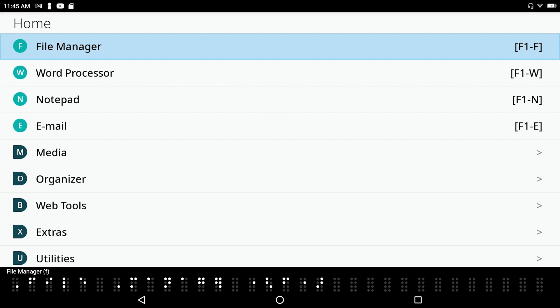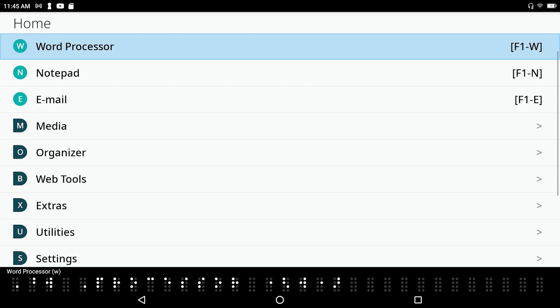I'm going to go ahead and create a quick database and show you how to add records. Anything that you want to track data on, if you can think of it, you can create it. I'll press F1 to get to the main menu. I can space dot-4 down until I get to organizer, but I know the shortcut key to open that folder is the letter O.